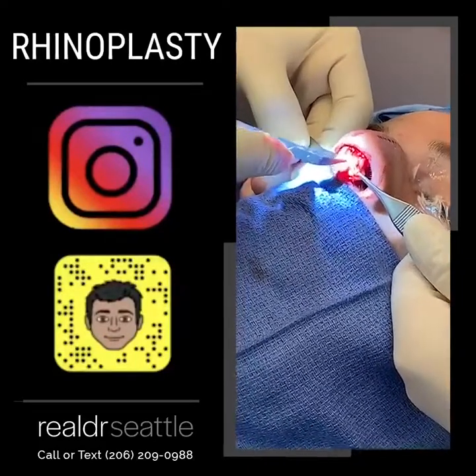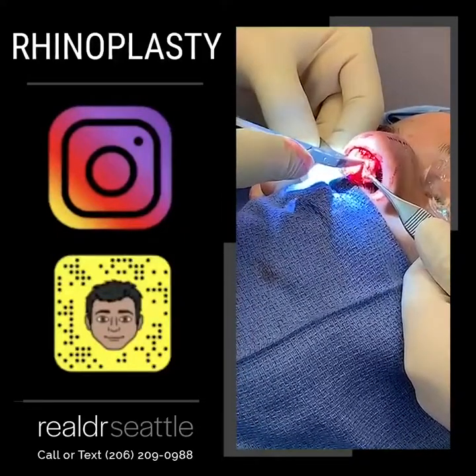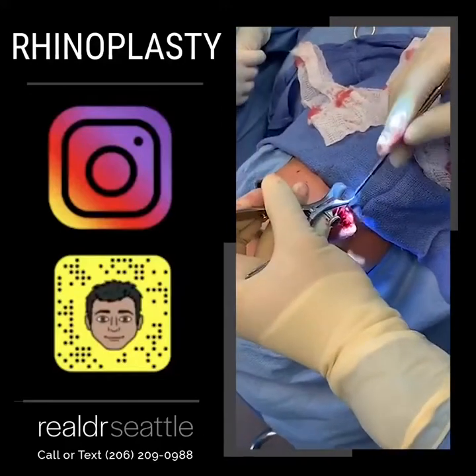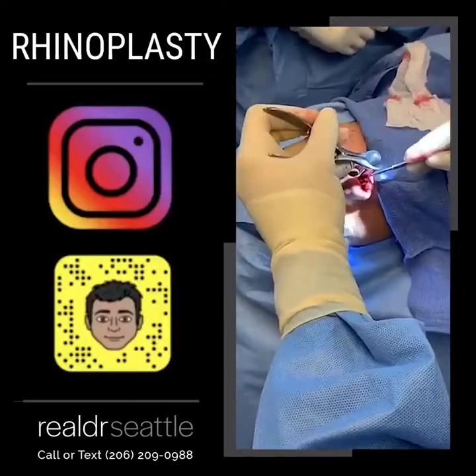Let me take our time. I'm using three times magnification right now to get the best possible view. In rhinoplasty, what I'm doing is separating the mucoperiochondrium, or the cartilage lining, off the septum of the nose.